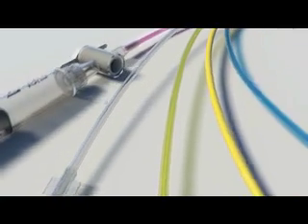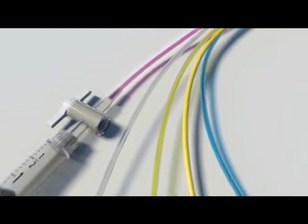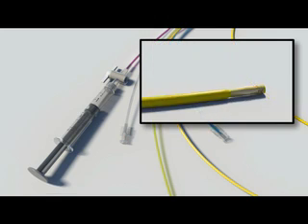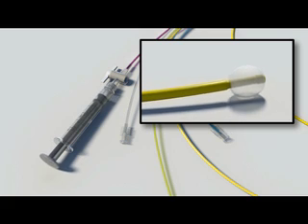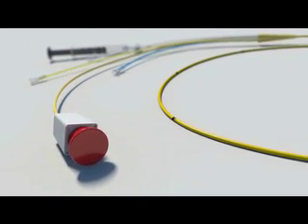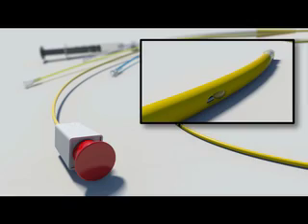A pink or red port is used to inflate the balloon at the catheter tip. Use only the syringe packaged with the catheter, as it fills only to the balloon's capacity. When fully inflated, the balloon should completely encircle the tip of the catheter, which reduces mechanical trauma during insertion. It is essential that the balloon be inflated whenever the catheter is advanced and then deflated whenever the catheter is withdrawn. The final port is connected to a thermistor near the catheter tip and can be connected to a computer for measurement of cardiac output by thermodilution.